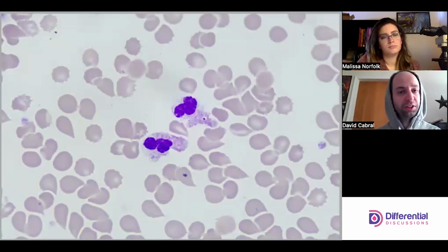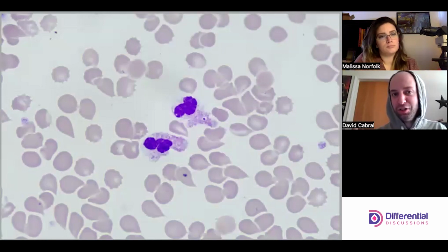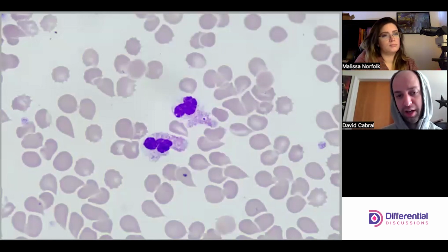Anaplasma, because bacteria are principally DNA organisms, looks like this: you'd see the polysegmented neutrophil nucleus, a bright green nucleus, and then in the cytoplasm of the neutrophil you see a green rod or a green dot. That's unusual. If it was some kind of an RNA inclusion, which you might see in white cells, it would be orange.